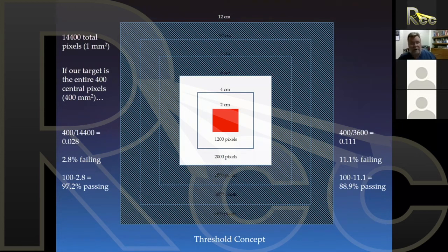Why are we failing? So basically, this is what thresholding is. We adopted 10% many years ago. This is what is recommended now. We have also looked at setting that threshold to whatever your lowest organ at risk tolerance is. So if it was, let's say, the spinal cord at 50 gray, whatever 50 gray is with respect to the total, that percentage would be where we set the tolerance. We weren't interested in anything lower than that. So we've even looked at this. But in general, they like us to look at 10%.